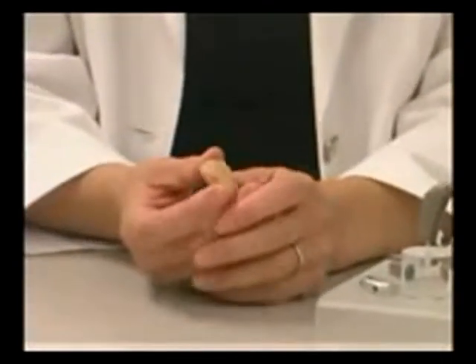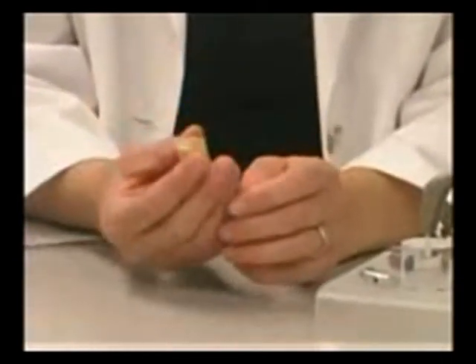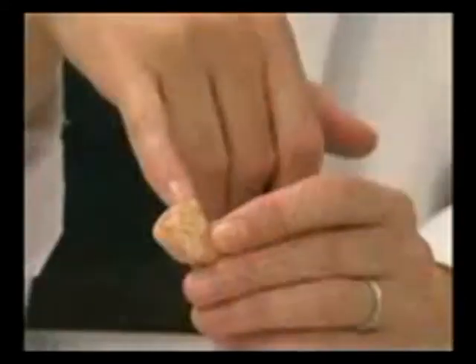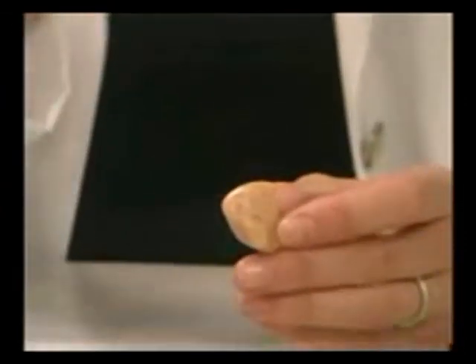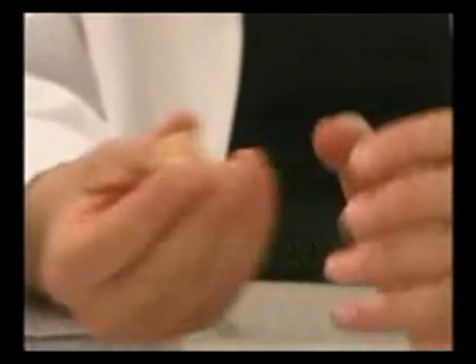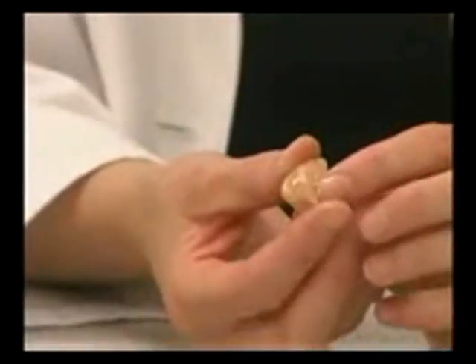The main advantage of the digital technology in a hearing aid is in the amount of flexibility and control that we now have over the sound that the hearing aid produces. We can do much more with a digital signal than we could with the older analog hearing aids. What happens in a digital hearing aid, the hearing aids look essentially the same. Once the sound is picked up by the microphone, it is converted to a digital signal or a sequence of code. And we can do so much more with that code than we could with the older technology.